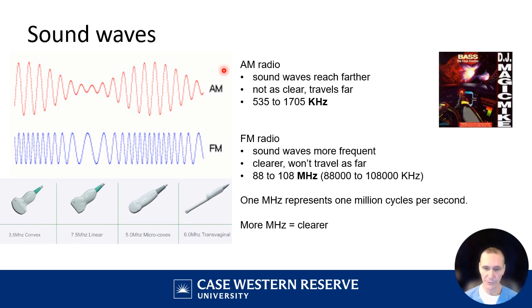You can hear them from a far distance, but they don't always sound so clear. On the other side of the spectrum, you have higher frequency sound waves, and I like to tell people, think of FM radio. FM radio sounds good, it's clearer, but you can't hear it from the distances that you would an AM radio station.